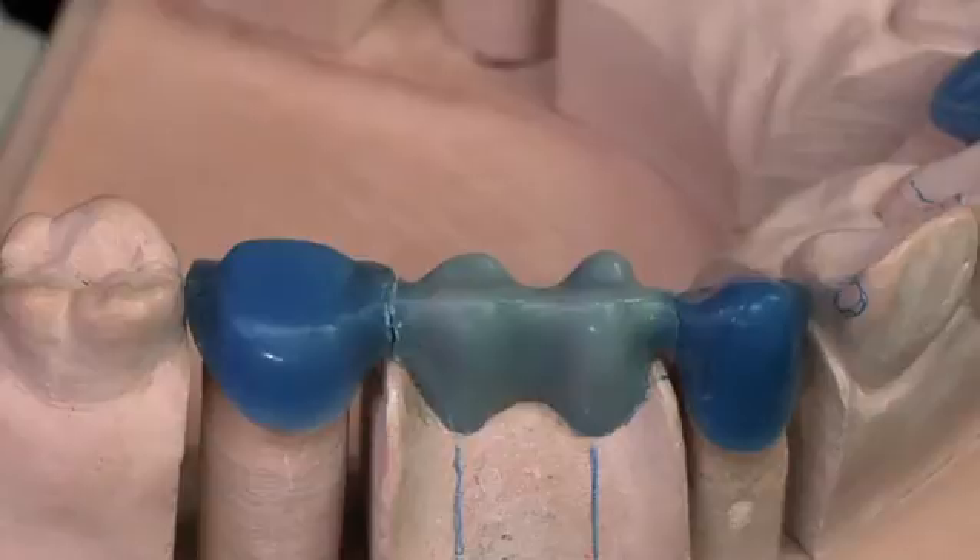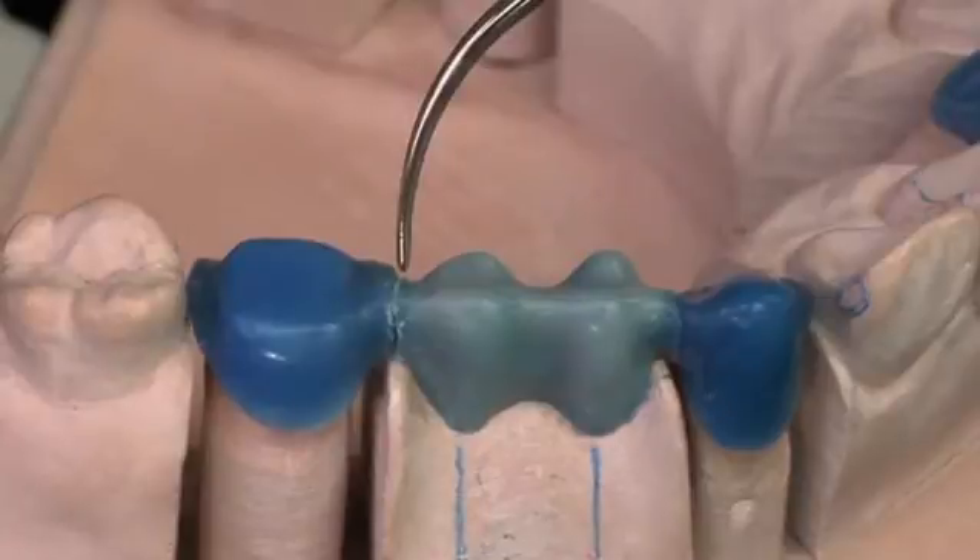I'm only going to cover one connector. I've mounted the needle tip in my Ultra Spatula and I've set the temperature so that it's just above the melting point of the wax I'm going to be using to close this connector.